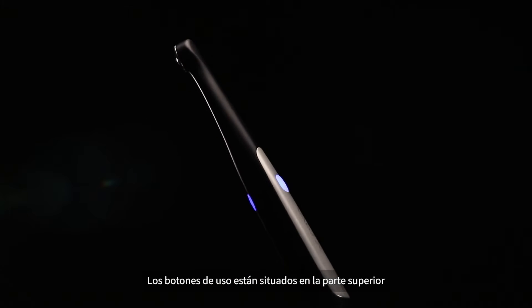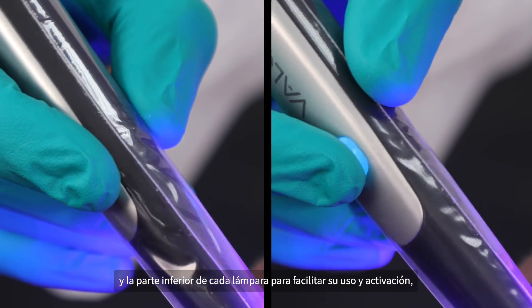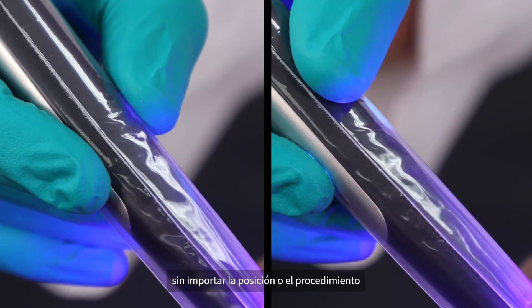The function buttons are conveniently located on both the top and bottom of each unit for easy operation and activation, no matter the position or procedure.